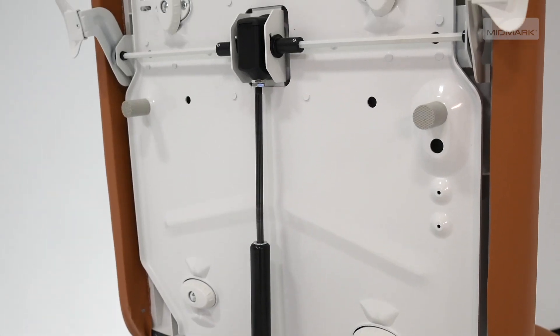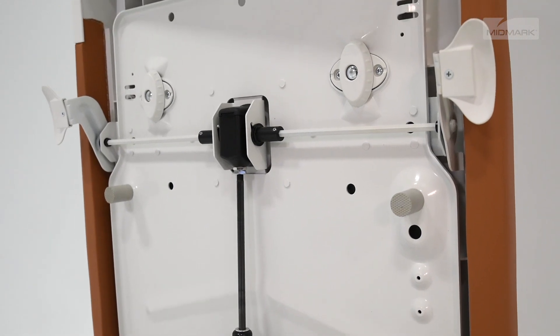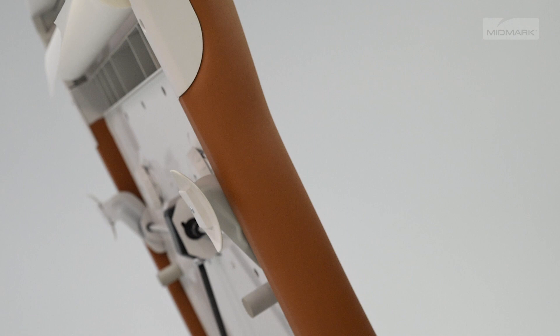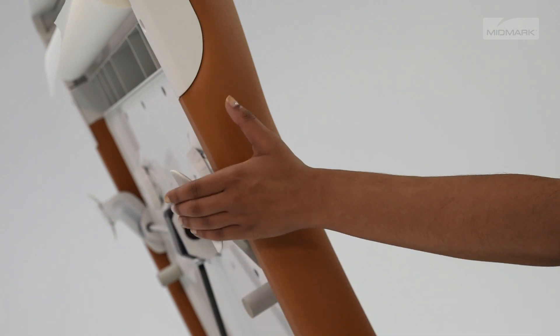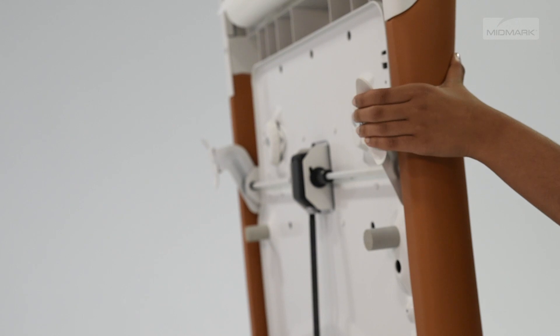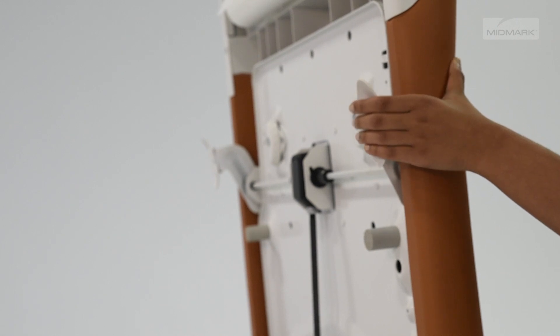Some models have a non-powered back. To position the back section on these models, first hold the back section in place while squeezing the back release handle on either side of the chair. Move the back section to the desired position and release the handle to lock the back.